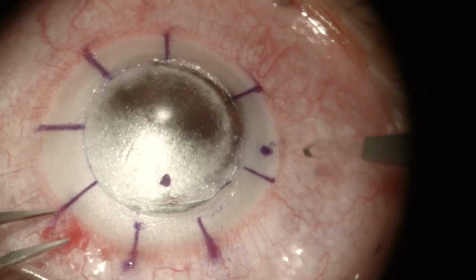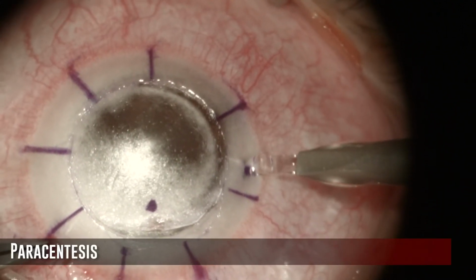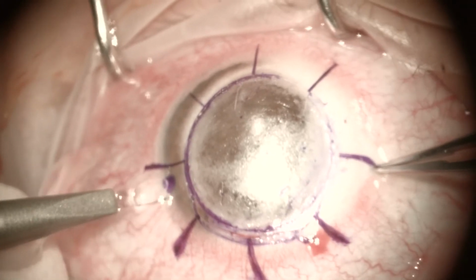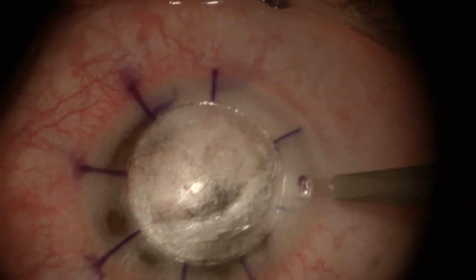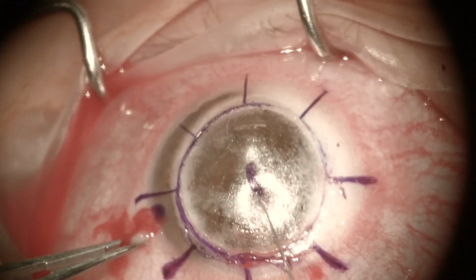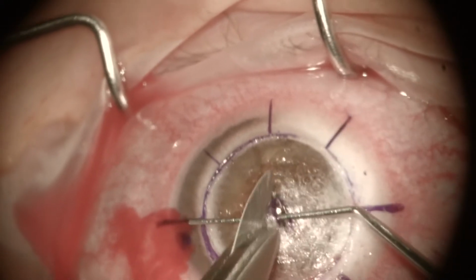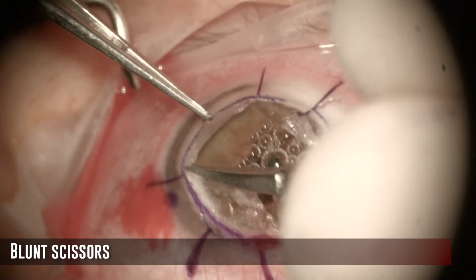Once the big bubble is created with the appropriate size, we strongly recommend creating a paracentesis in order to decompress the anterior chamber. This avoids inducing iris ischemia due to the elevation of the aqueous humor pressure. Always create the incision far away from the bubble to avoid puncturing it. The slash maneuver is performed with a 15 degrees blade. To create the petals, always use blunt scissors.